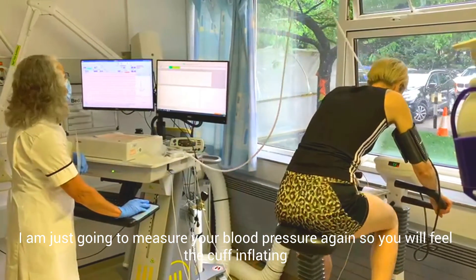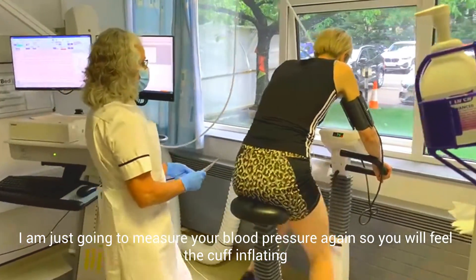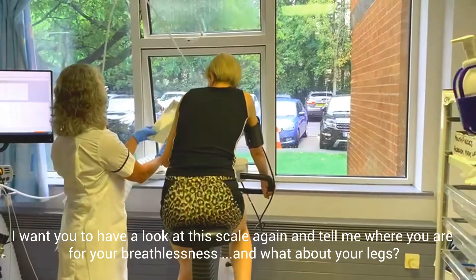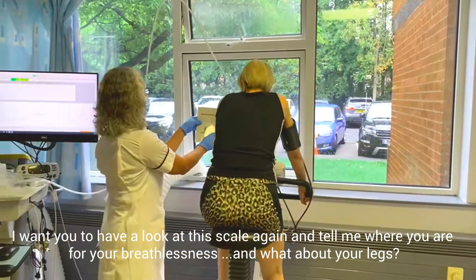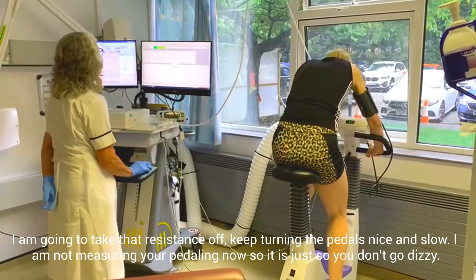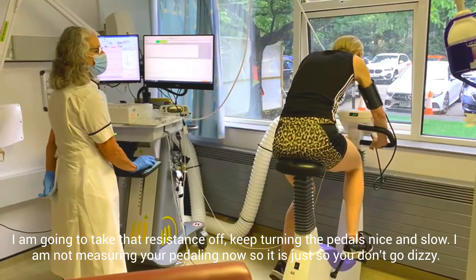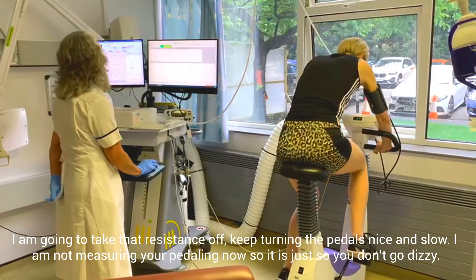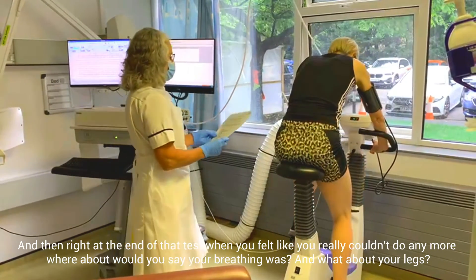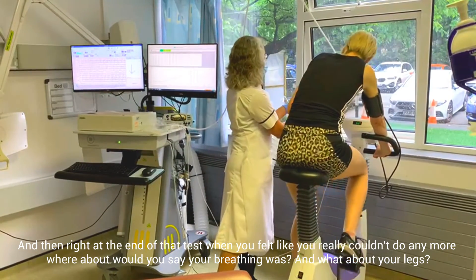And then we'll measure your blood pressure again — you'll feel that cuff inflating. And then I want you to have a look at this scale again and tell me where you are with your breathing and what about your legs. Get that resistance up there, keep turning the pedals. Just keep turning nice and slow — I'm not measuring your pedalling now, it's just so that you don't go dizzy. And right at the end of the test when you felt like you really couldn't do any more, whereabouts would you say your breathing was? And what about your legs?